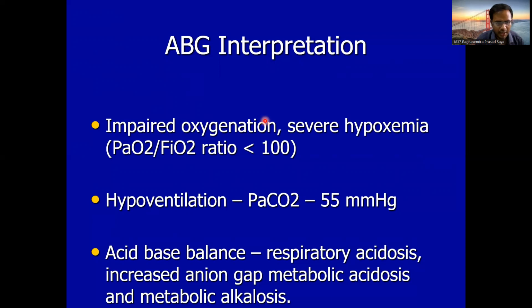Likewise, you can take any number of examples of ABGs available in your hospital and use this stepwise approach. There is this 10-step approach for ABG interpretation.